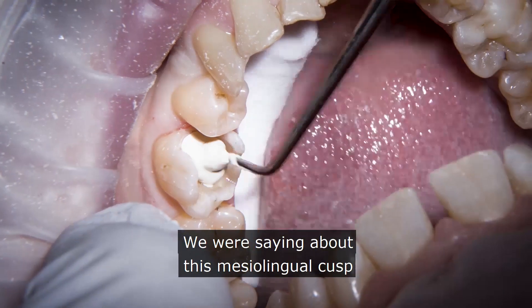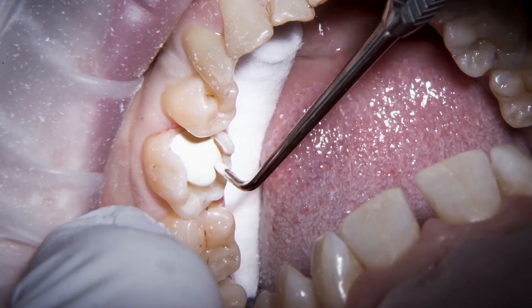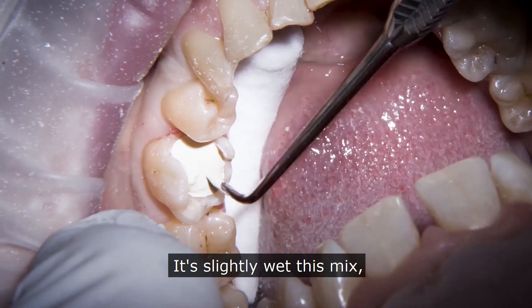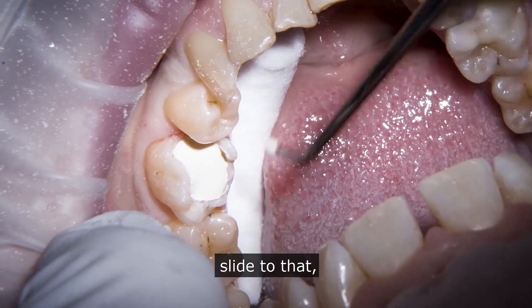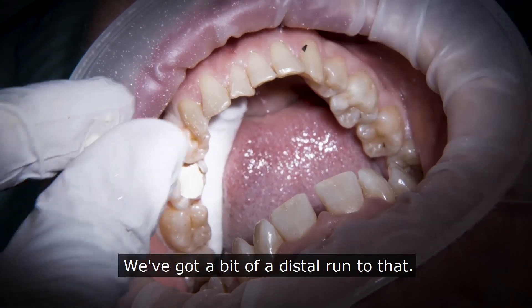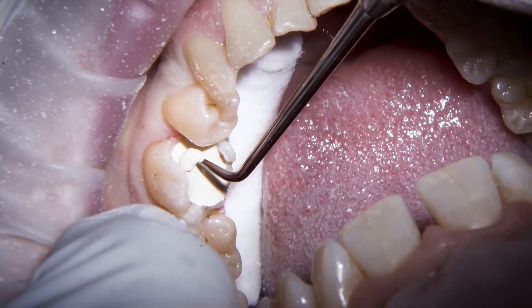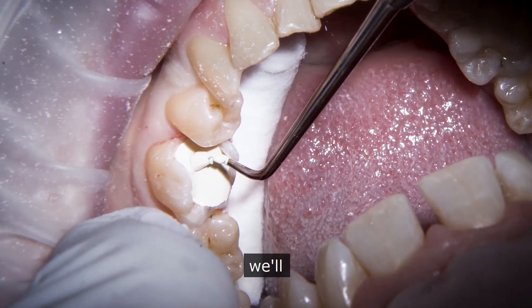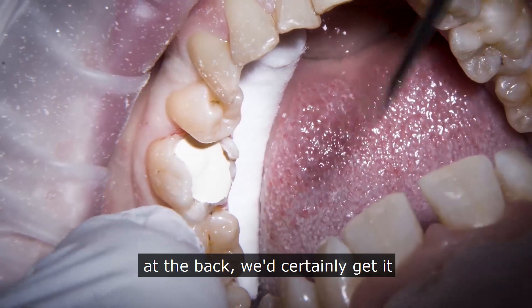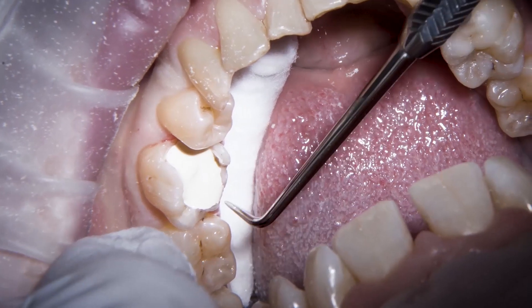I want to get that mesiolingual cusp nicely adhered to the inside of the cavity, so we just start to build in some resilience to that cusp, teasing it into position. It is slightly wet, this mix — we've got a little distal slide to it. There's a little bit of a distal run where I'd like to see a little bit more shaping — should have tried it a fraction drier. But if I touch it now at the back I'd certainly get it flowing further back where I don't want it to, so I'm just going to leave that setting.